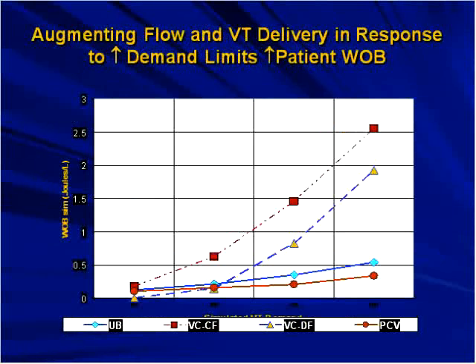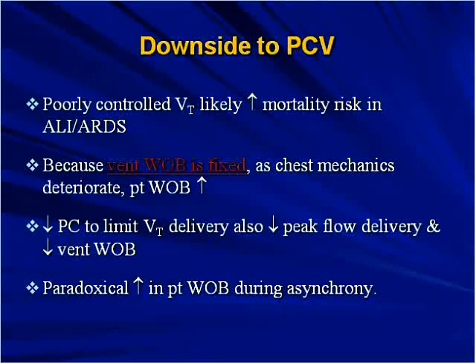So putting this together, putting the pressure control in with the volume control, what you'll see again, the blue is the unassisted breathing or the intrinsic workload on the muscles. As the tidal volume demand goes up, the work of breathing imposed on the patient goes up in volume control decelerating and volume control constant flow. But pressure control maintains work of breathing actually below the patient's intrinsic load. It actually offloads the work of breathing. So this is something good. That's a good tool to have in the tool chest.